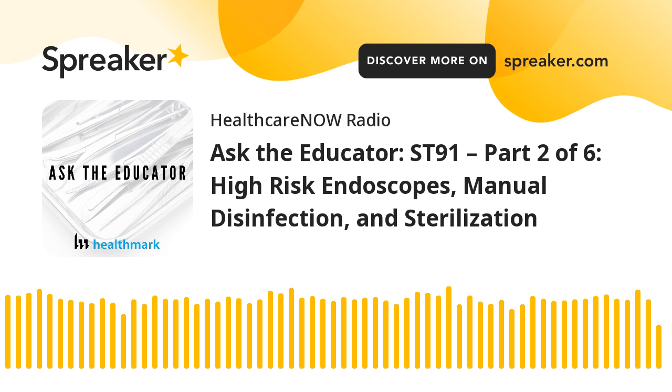So we started out with just changing the requirements and recommendations for cleaning verification testing based on the designation of whether it's high risk or not. And I won't get into too much detail because I think it's going to be covered in another episode on ST91. But in general, the new standard says that every high risk endoscope shall, and remember we talked about wording in the previous episode, shall is a requirement of the standard.